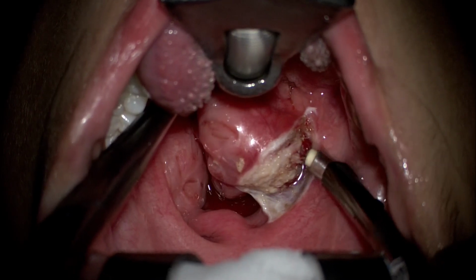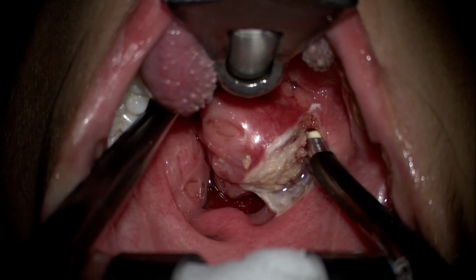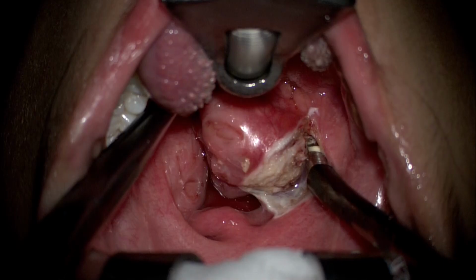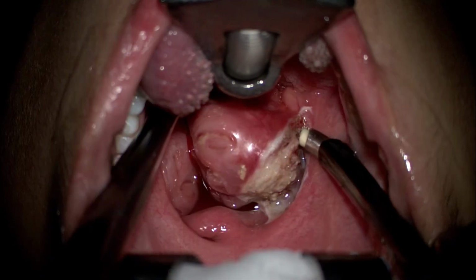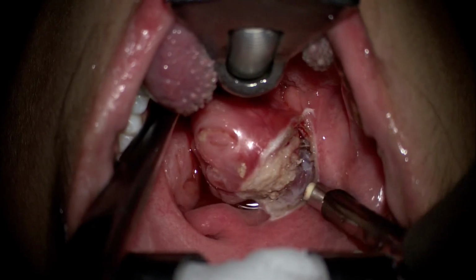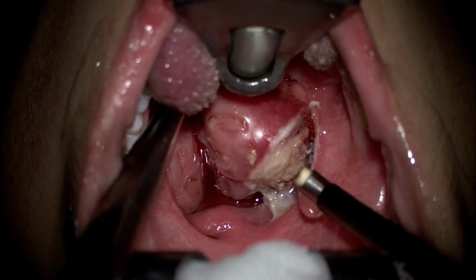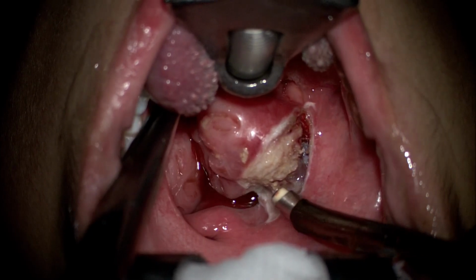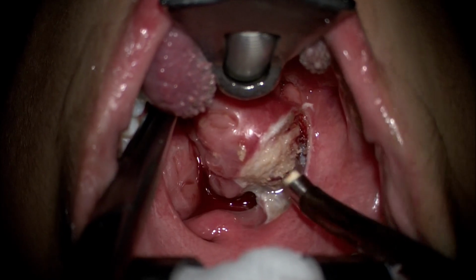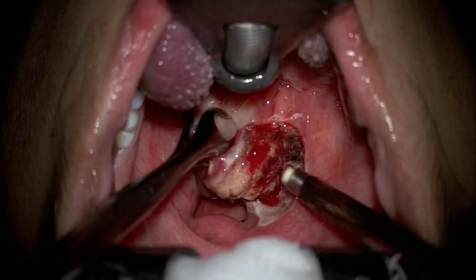Now, post the superior part of dissection, we take our coblation device and continue the dissection inferiorly. As you can see here, there is a slight amount of bleeding, which can be safely coagulated very easily using the same device without switching to a bipolar cautery or something else. Some amount of muscle may be exposed during this surgery. However, it is best that the exposure is kept minimal, and that helps us in reducing the post-operative pain and expediting early and fast healing.